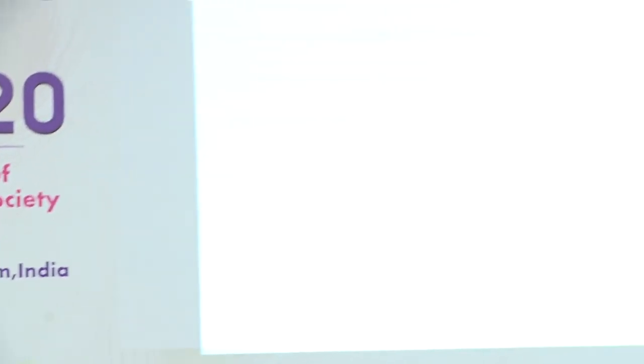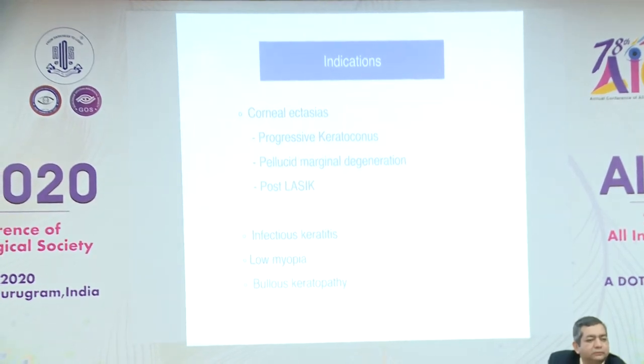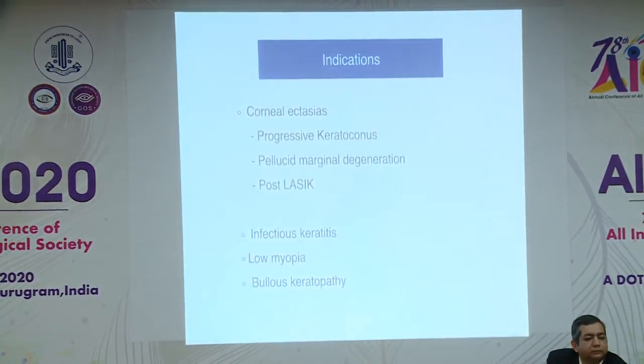Good afternoon, everybody. Today I'll be talking on cross-linking protocols, which is best for my patient. And I'll just skip through the basic things so that I finish it in 3 to 4 minutes. So we all know that collagen cross-linking is mainly used for corneal ectatic diseases, and the current indications include corneal ectasias, infectious keratitis, low myopia, and even in bullous keratopathy, people have used it.